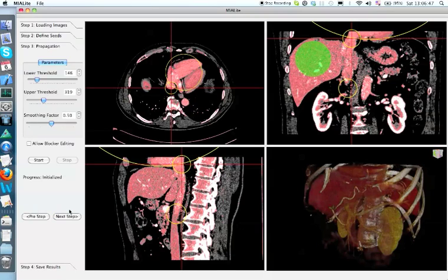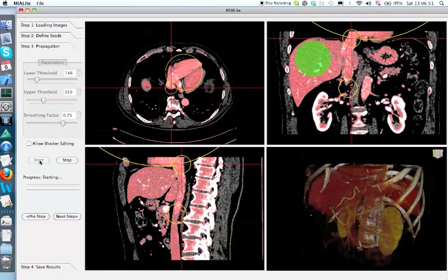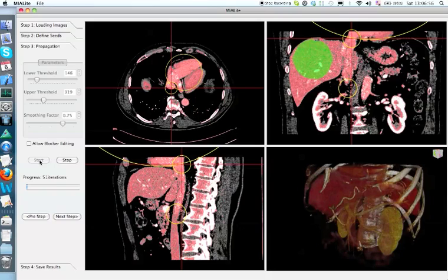Here we are going to use a very high smoothing factor to go over the small holes inside the liver mask, and also to prevent the region leak to nearby structures like stomach.